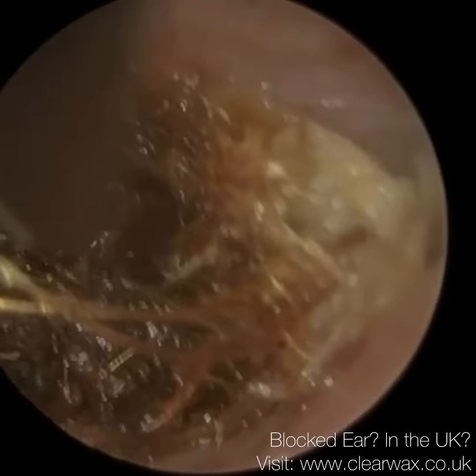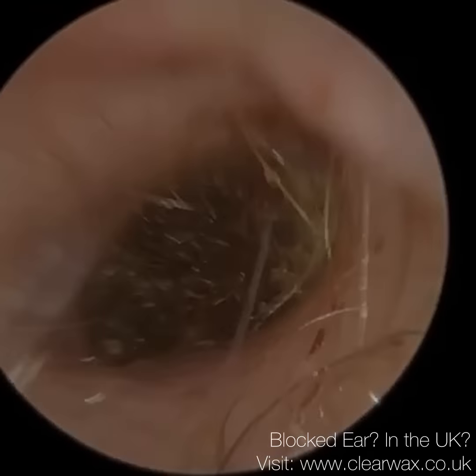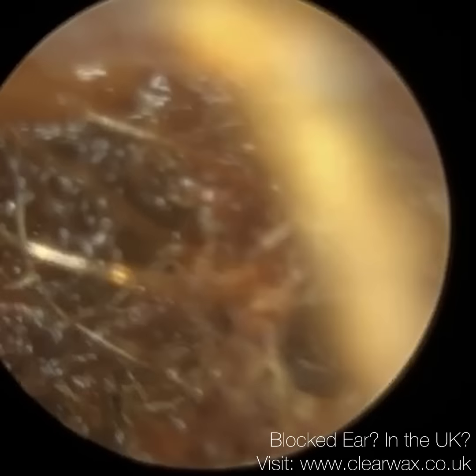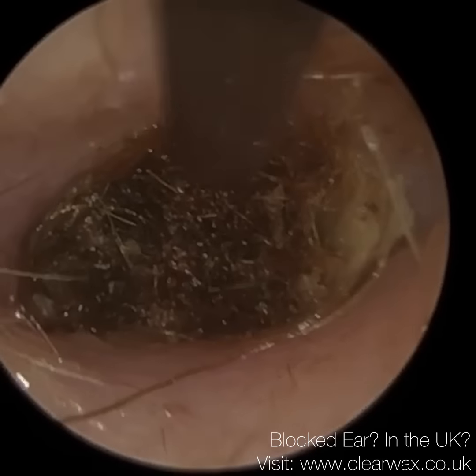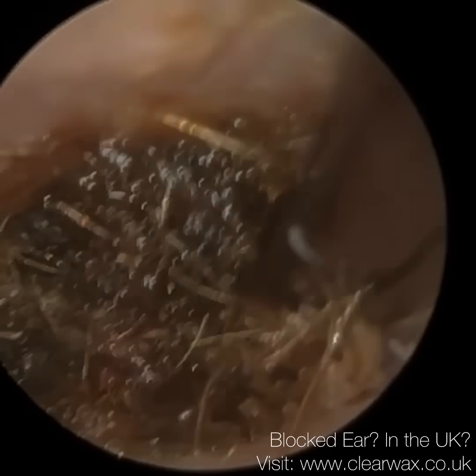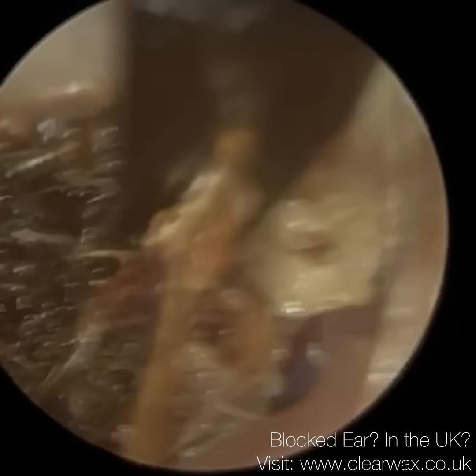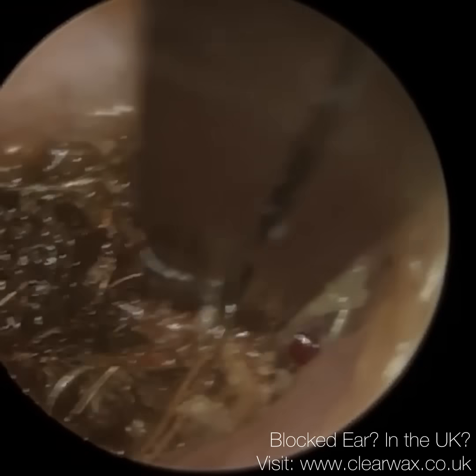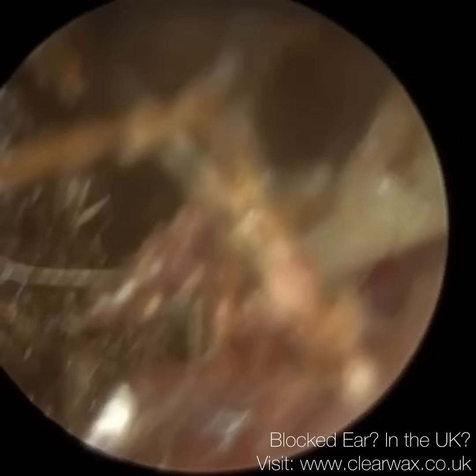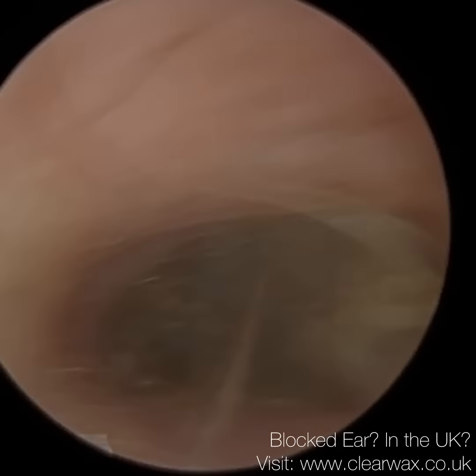You can see the white peripheral matrix, which is typical of a keratosis obturans. And the other main symptom this patient had was severe earache, otalgia, which is also another hallmark symptom of keratosis obturans. In addition, they had some granulation tissue, which you're going to see appearing just there at the bottom of your screen. And there was also some bony remodeling of their ear canal, which is again typical of a keratosis obturans. And when we say bony remodeling, we mean a global widening of the ear canal.